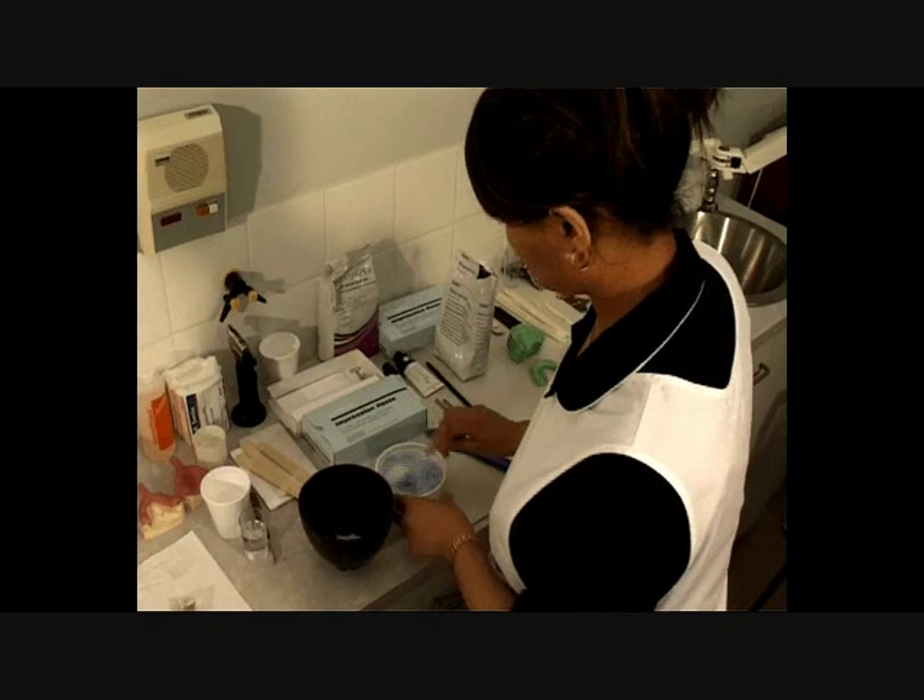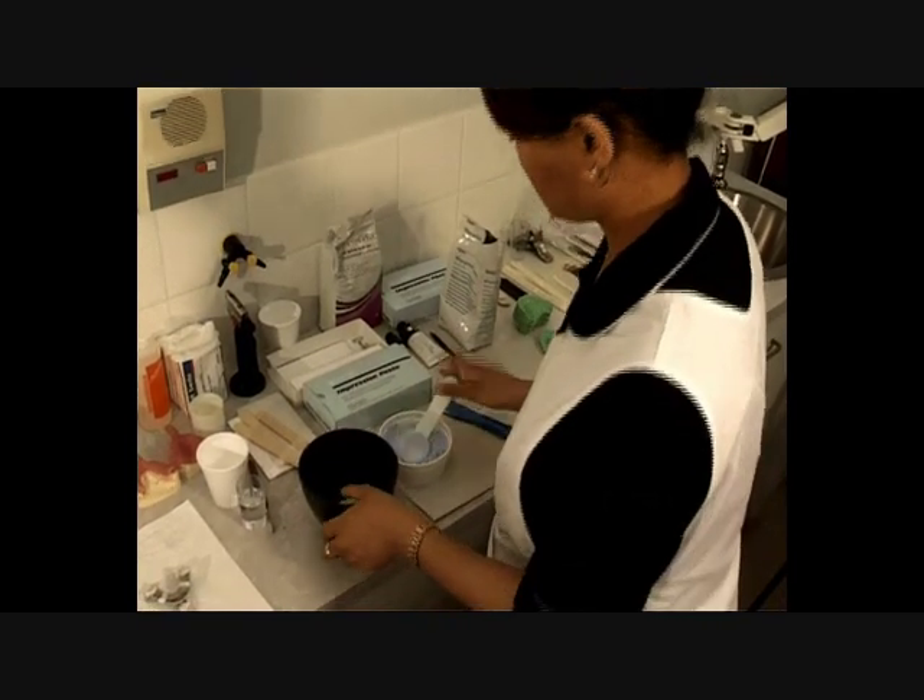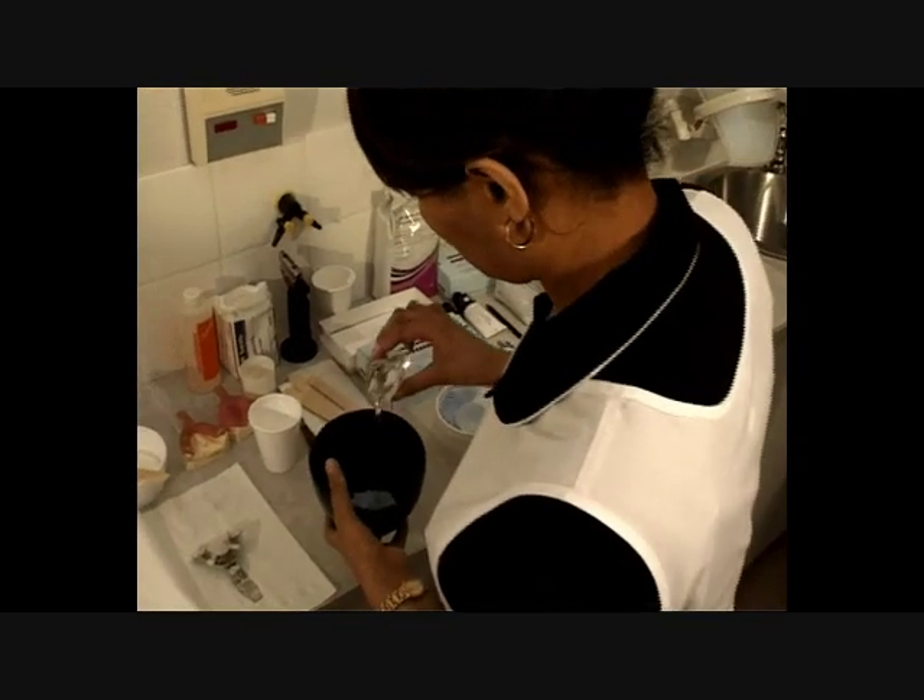Step 2. Mix alginate according to the manufacturer's instructions and load level with the border of the tray.